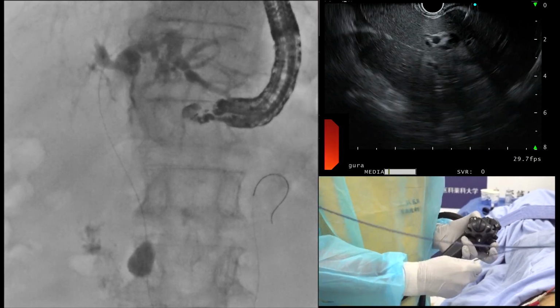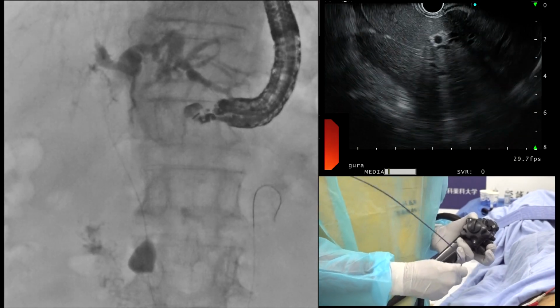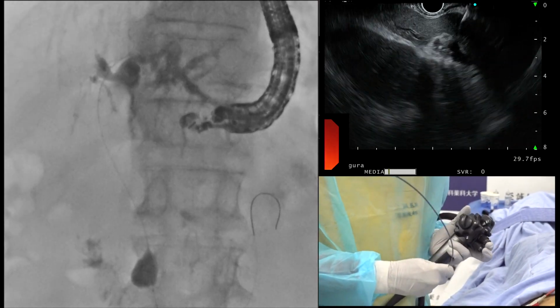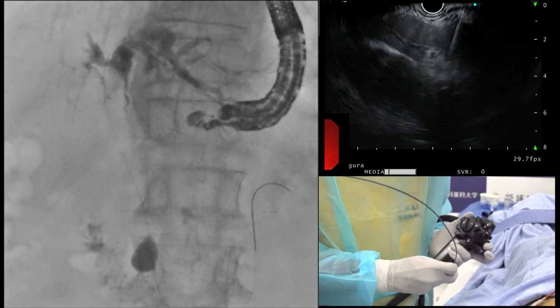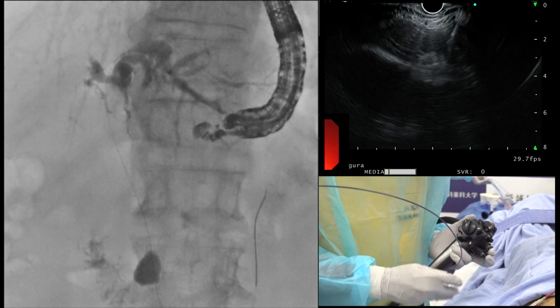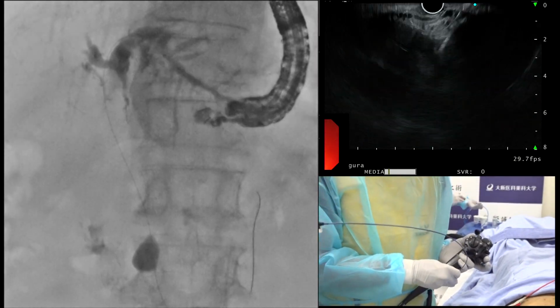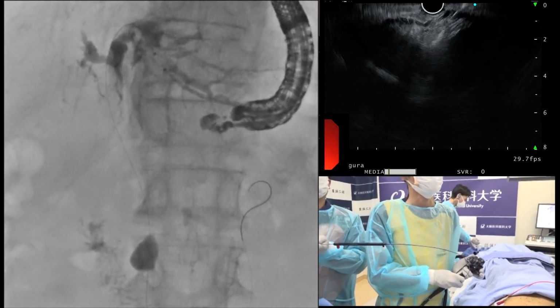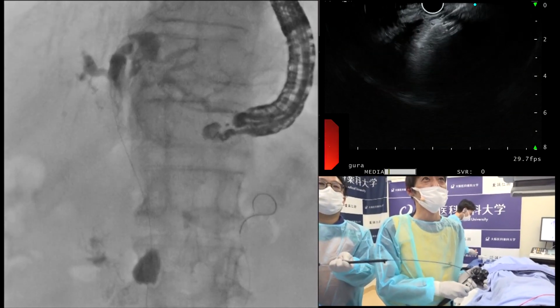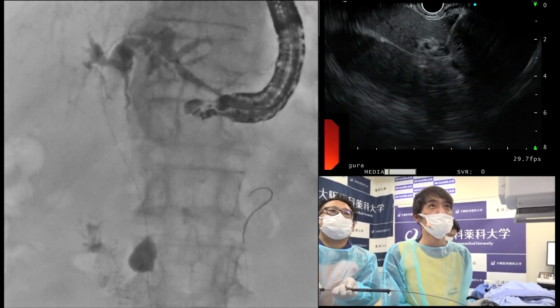But according to our previous analysis, compared with duodenal obstruction, compared with EUS-CDS, stent patency may be longer in hepaticogastrostomy. But this bile duct wall is very hard.